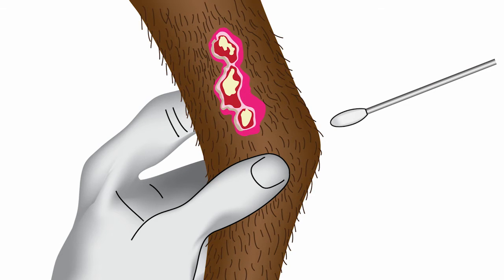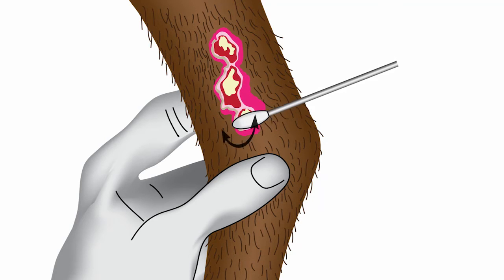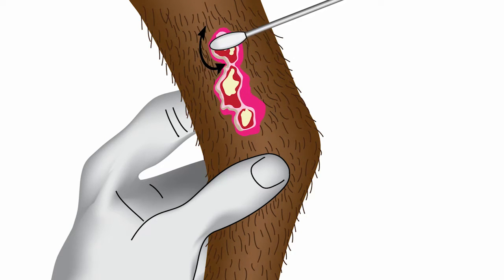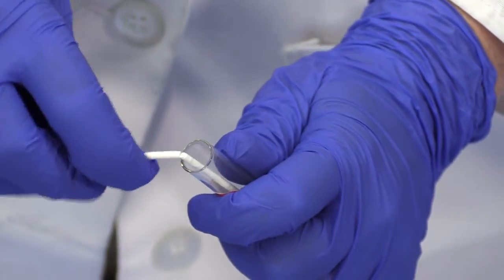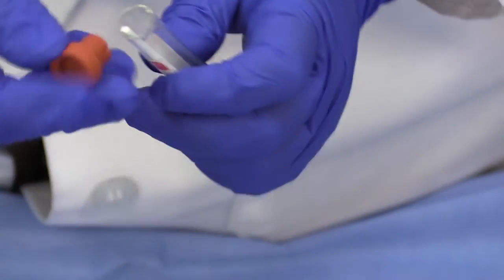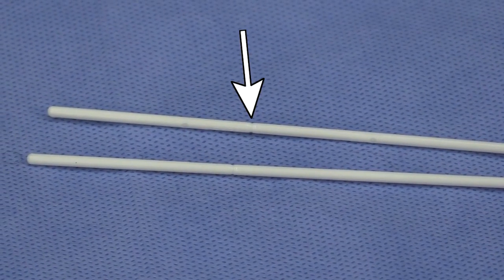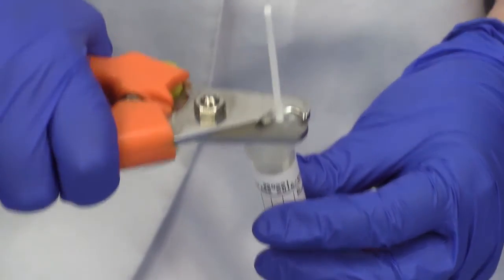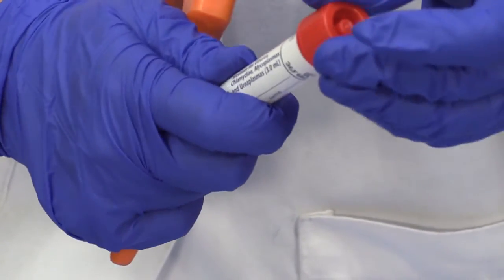For locations that are easily accessible, collect your swab sample by gently but firmly rolling it across the lesion or area of interest. After placing the swab in the selected media, the swab shaft should be broken or cut to allow the cap to be replaced. Breaking the shaft is easy if it has already been scored at the appropriate length by the manufacturer. Alternatively, the swab may be cut at the desired length. Securely close the container with the swab inside.